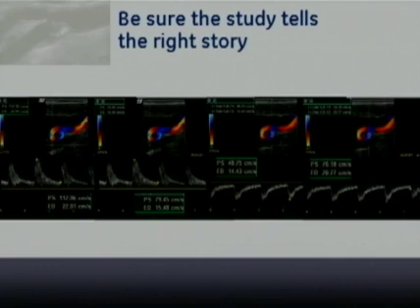You update the image, double check the location of your sample volume, and angle correct to the walls as it curves around. It's challenging to do, but make sure that the velocity values make sense. And sure enough, when I do this, my velocity is 70 centimeters per second, and that's more accurate. So in reality, in this coil, my velocities ranged from about 70 to 80 centimeters per second, never from 70 to 112, just down to 48. That doesn't make any sense.